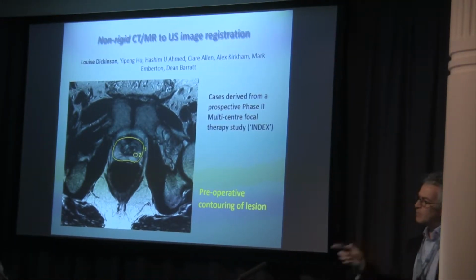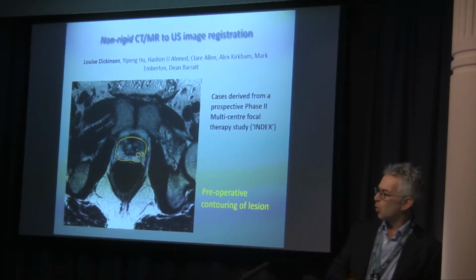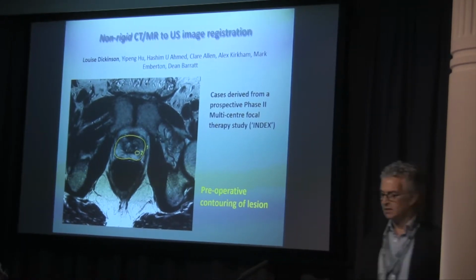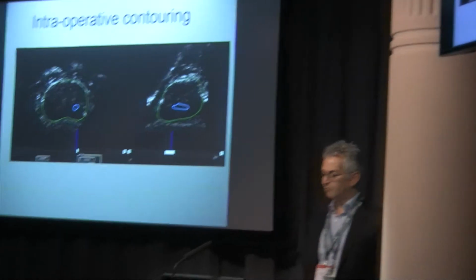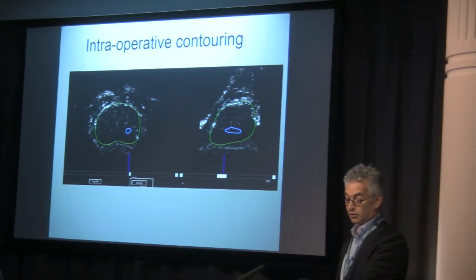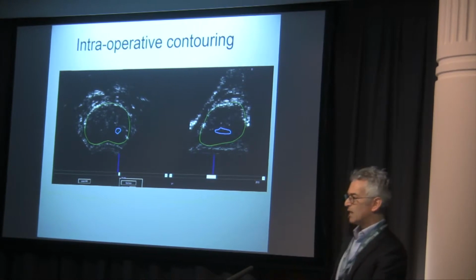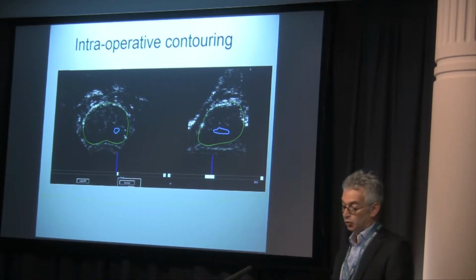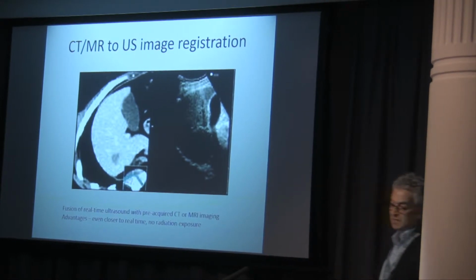All the different modalities have their strengths and weaknesses, and sometimes you want to take the strengths of one modality and use it with the flexibility and the ease of access of another. This is an example of taking information from MR and fusing it with an ultrasound image, in this case in the prostate, because clearly you're not going to see that little area that shone so nicely on the MR, but now you can get your landmarks in the one using the ultrasound, which is much more useful in the interventional suite.